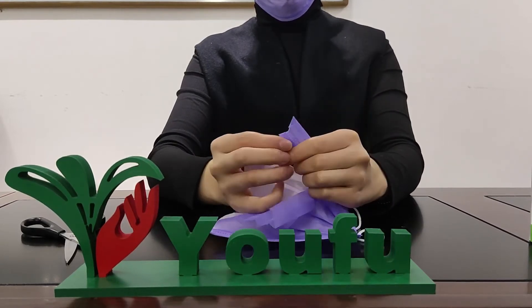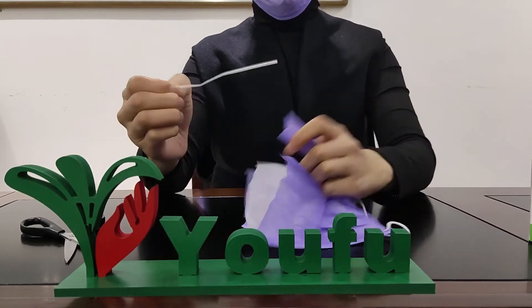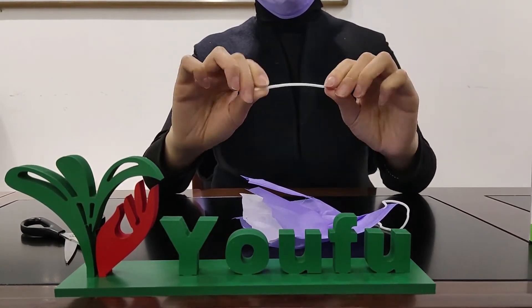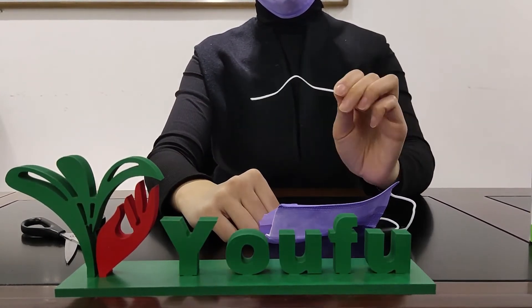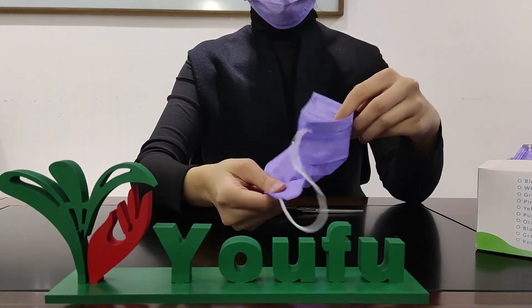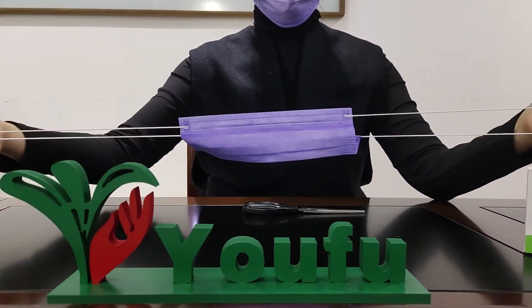Skin-friendly and breathable for wearing. The adjustable nose bar makes the face mask fit most face shapes well. No matter for public use or for medical use, our high-quality face mask could be your best choice.